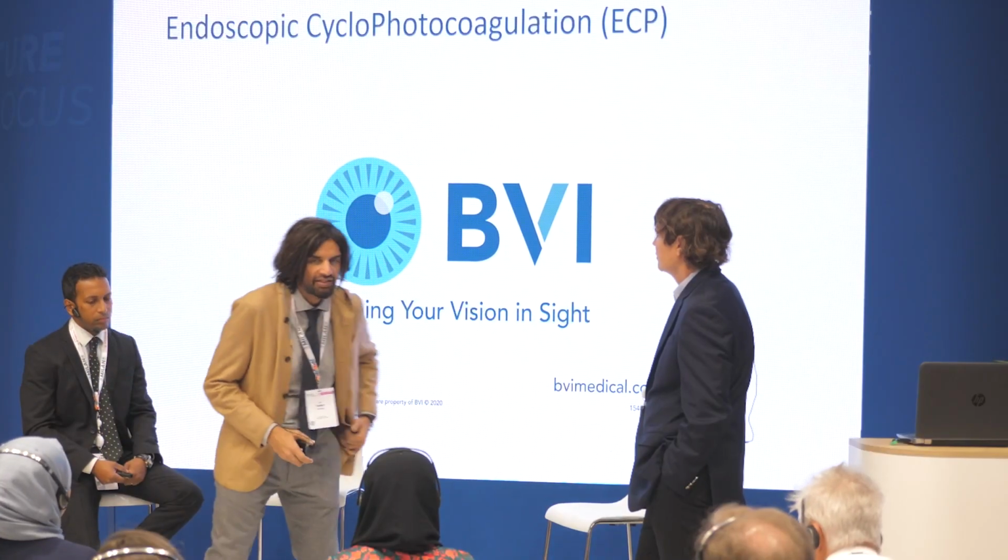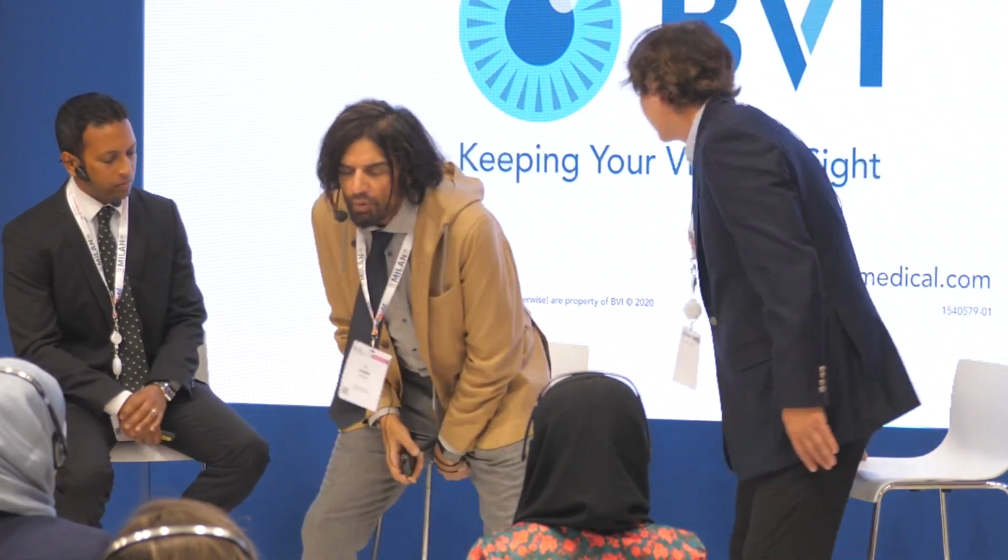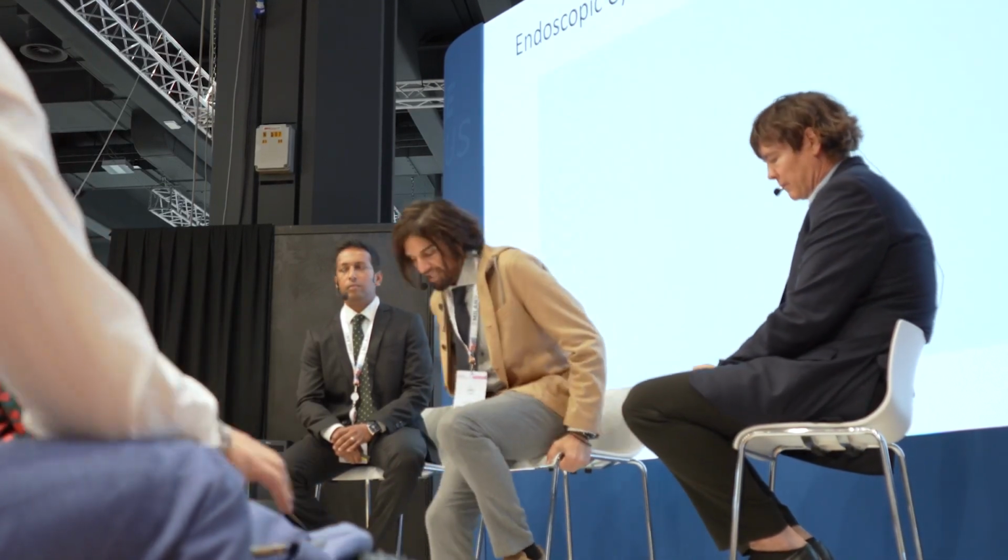So thanks for showing that video. I thought that's helpful. One of the questions we always ask ourselves, we're in the era of MIGS, right? MIGS has taken hold as an important glaucoma procedure we often use. MIGS we define as typically ab interno, microincisional procedures that are ultimately much safer than traditional surgeries.